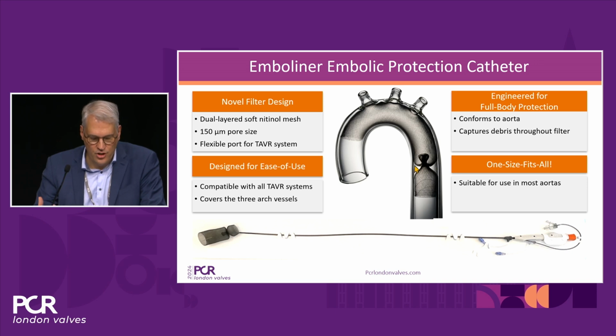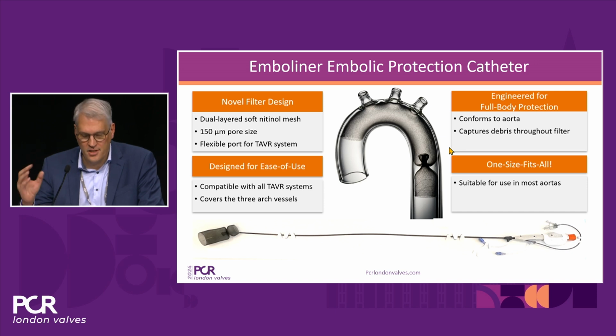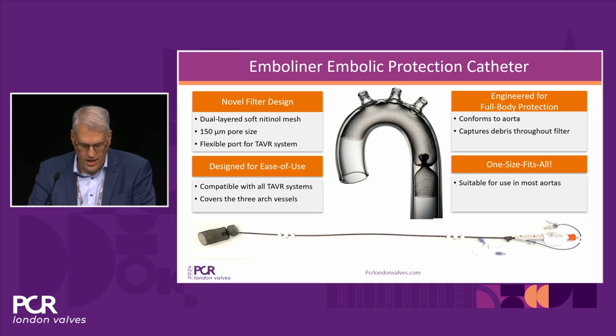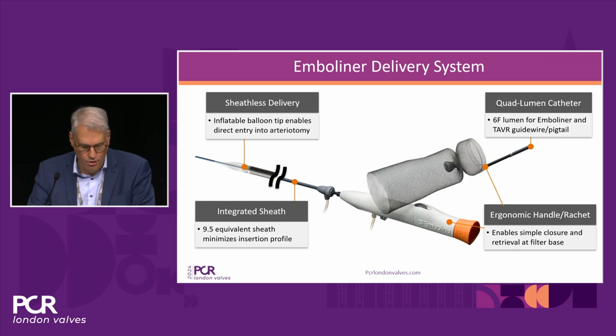It's designed for a very easy use. It's compatible with all existing TAVR systems, and it conforms to more or less all aortic anatomies. Of course, this one-size-fits-all concept is not entirely true. If you have a large aorta, it does not work. But in really most patients, it's absolutely feasible to have a full protection of the aorta.